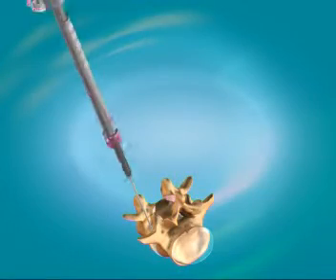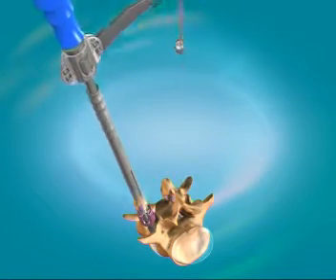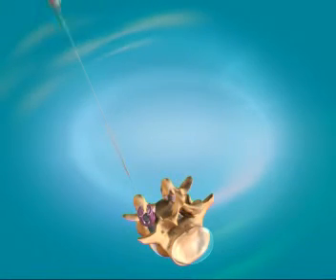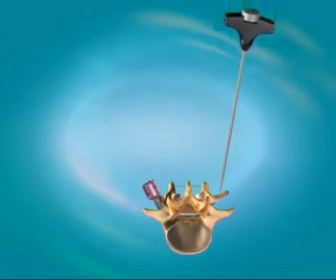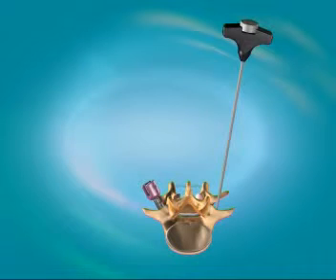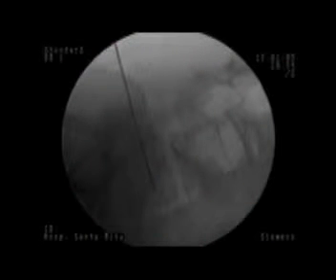Pedicle screw insertion. Accurate screw placement is important for the successful implantation of the TOPS system. Therefore, the use of K-wire to assist in pedicle screw placement is highly recommended. You should perform the insertion into the targeted vertebrae using your standard surgical technique under X-ray guidance, keeping in mind the following 4 points.